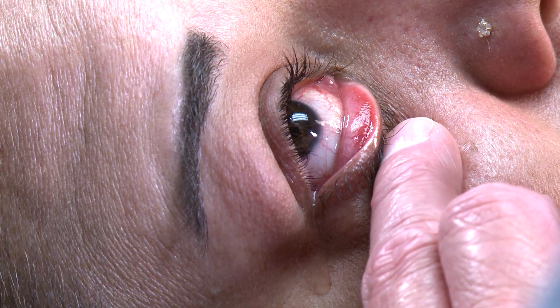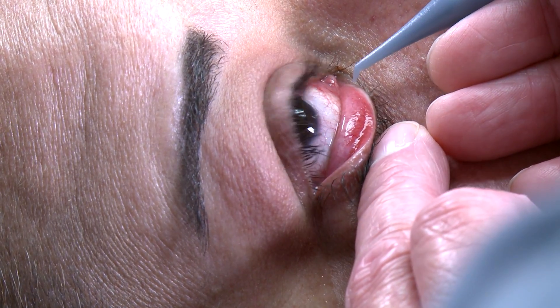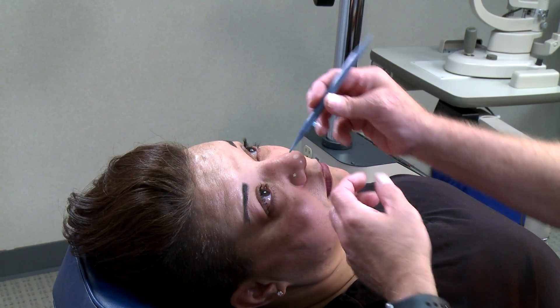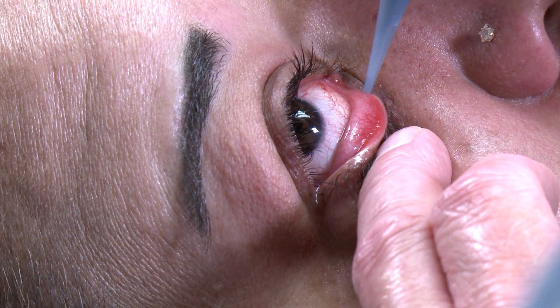First I'm going to dilate her lower punctum with the dilator. It's built into the inserter, so we know that that plug will fit just fine. And then we turn it around, and I insert the plug, push the release button, and it's in a perfect position.